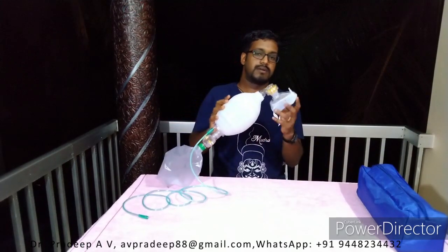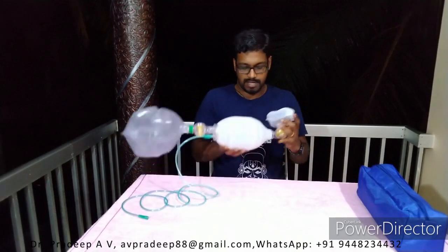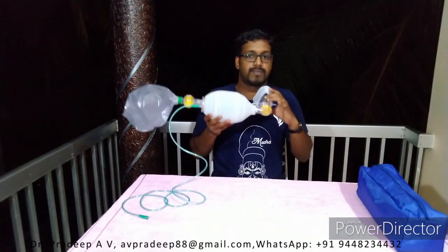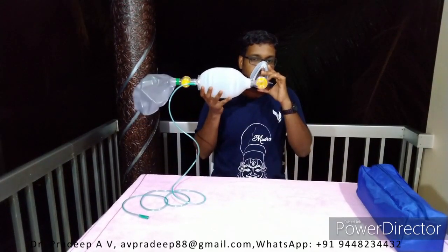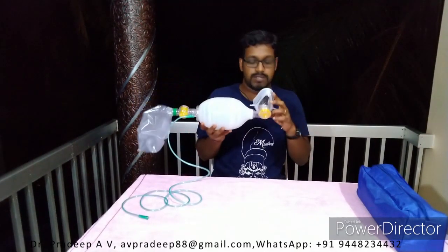And this part of the body is supposed to go to the face of a patient, so this can orient in any direction, and this goes here. So it goes to the face. So this is the protocol.